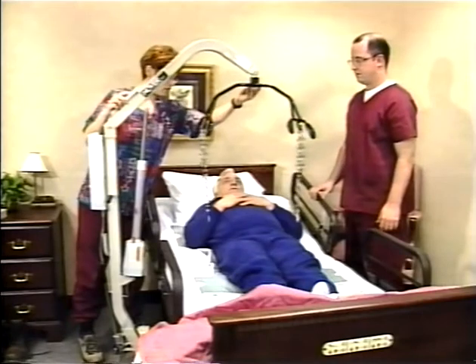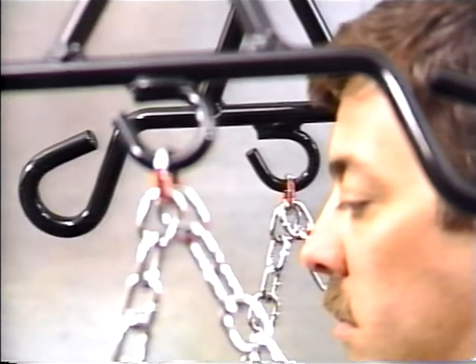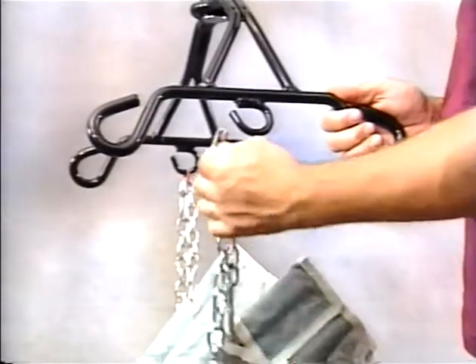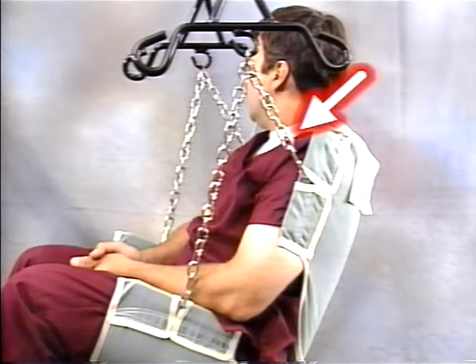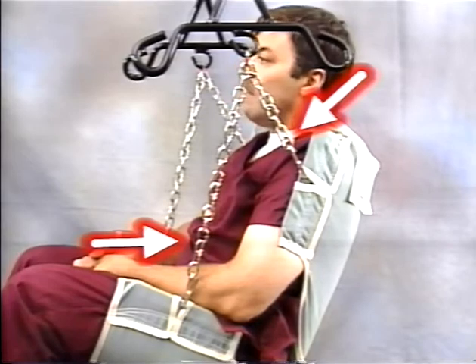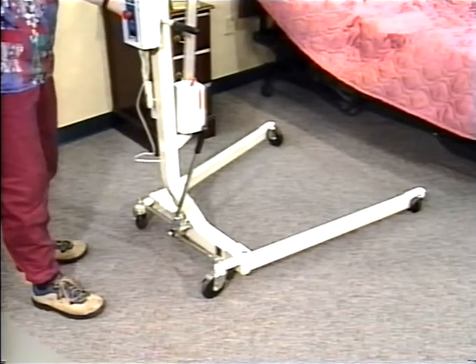Lower the swivel bar over your patient so the chains can easily be attached to the sling. The red indicator mark on the chain link is a start point for attaching the chain to the swivel bar. To help position your patient, the shorter linkage should be attached to the top shoulder portion of the sling, while the longer linkage should be attached to the lower leg portion of the sling. If you're using a lifter with adjustable legs, always spread the legs wide open before a lift.